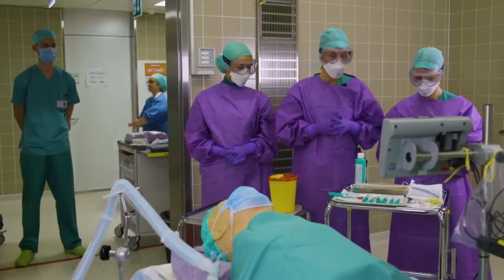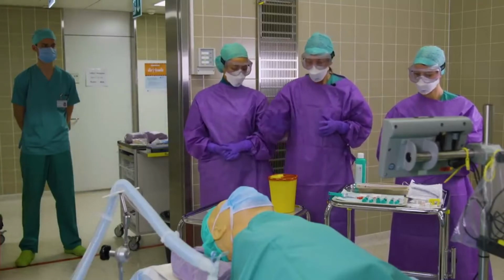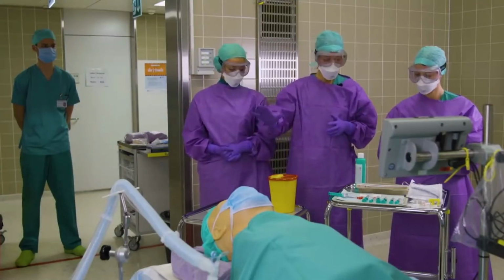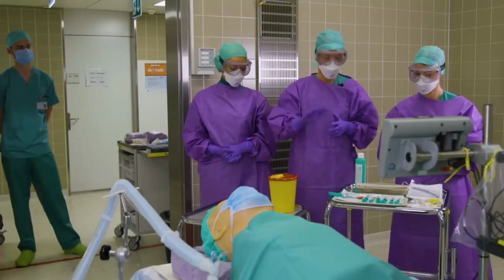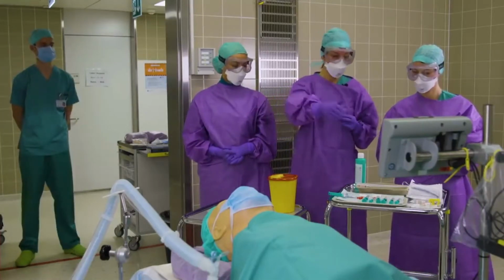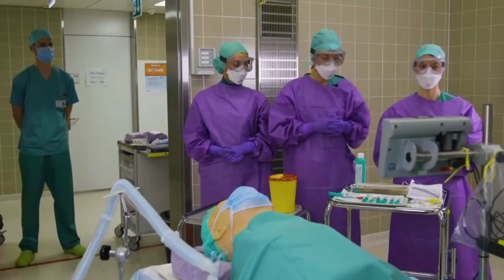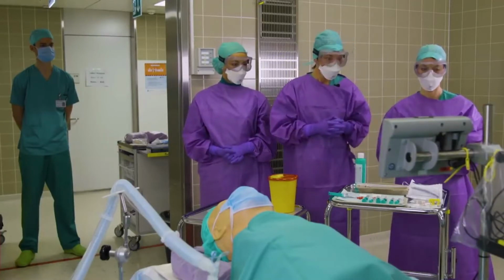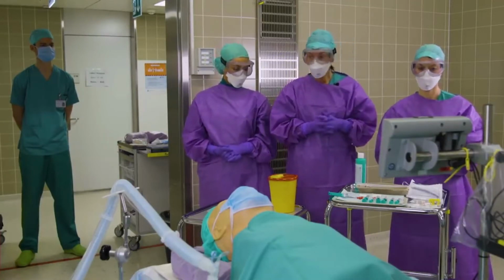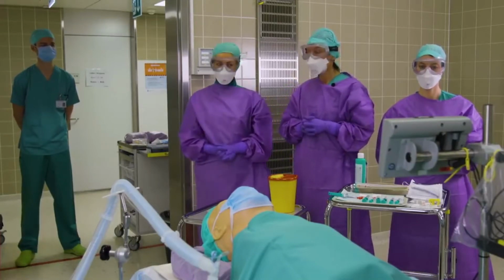Next to the induction table, we have our dirty tray for dirty materials to be disposed there. It's also important to have a trash bin next to the patient so you can drop dirty articles right into the trash bin. Outside we have Tim, who is our clean person and jumper. In case we need medications or airway material, he will be able to hand them to us.